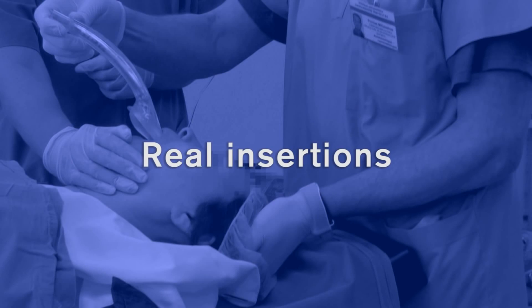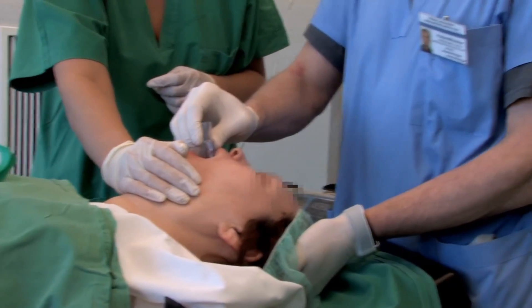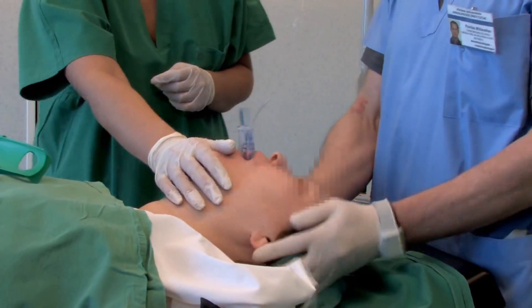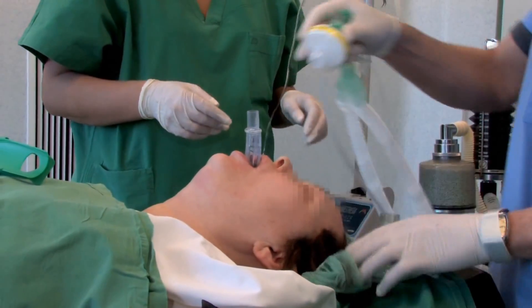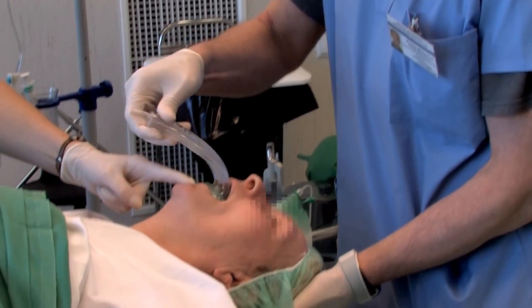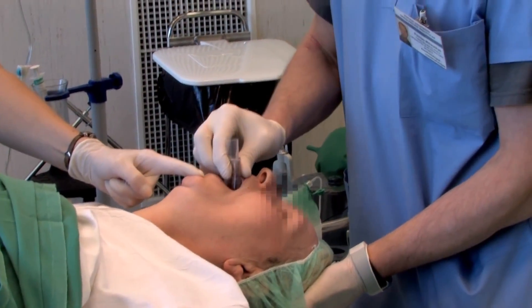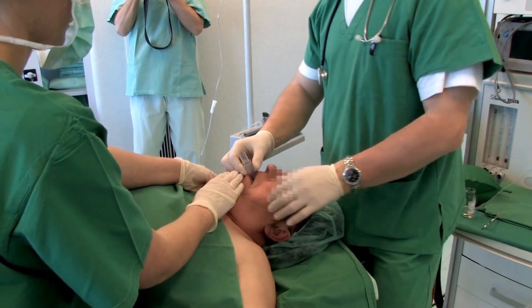Let's look at some iGel insertions in real patients. Note the sniffing the morning air position and the gentle press down on the chin. See how there is no need for fingers to be inserted in the mouth. There is never a need to apply excessive force or to repeatedly push down on the device once definitive resistance has been felt.